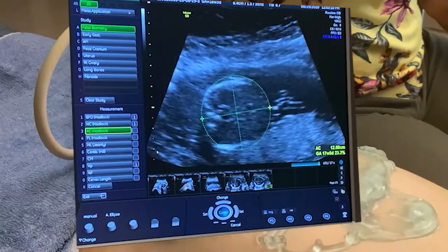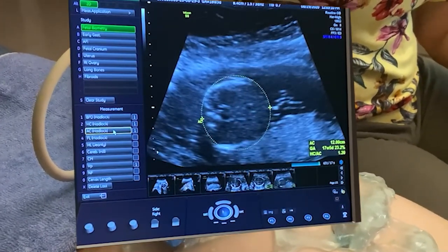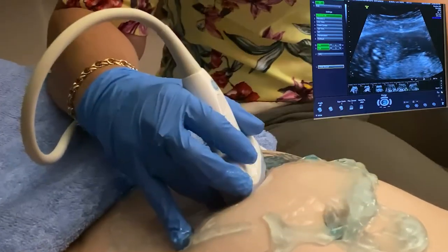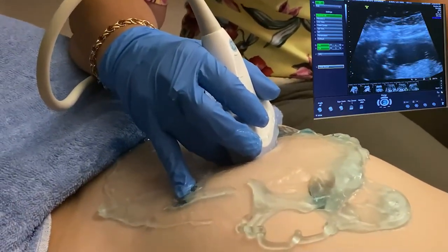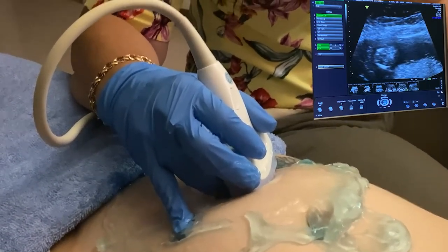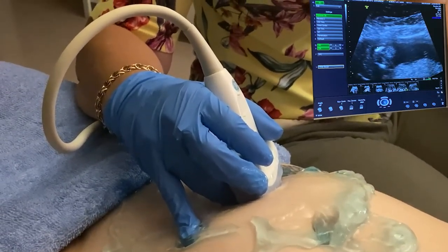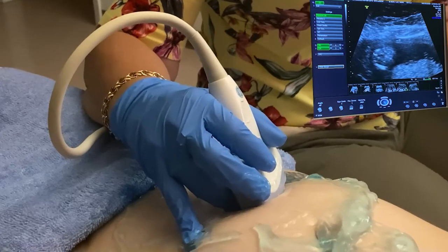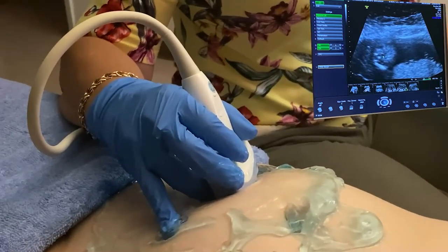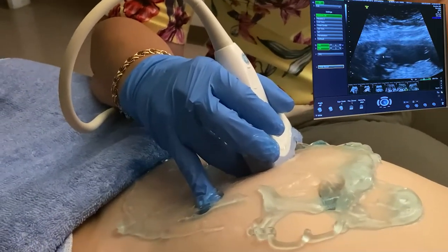So we're just going to measure all around, like if we're taking the baby and measuring it for its first belt, for example. My movements are very small, and I'm going inferior to baby, which in this case, since the baby's vertex is towards mom's head. We approach the alas, which is the pelvic wing of the baby. Now I'm looking at the spine as I go, I'm looking at the aorta, I'm making sure that the anatomy that I can see appears as it should.